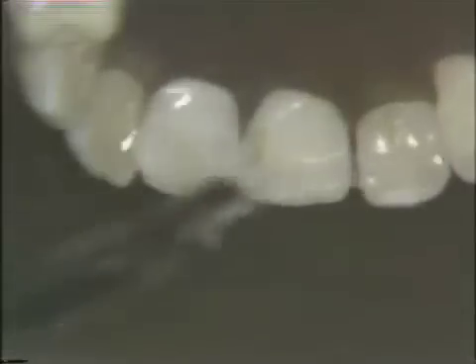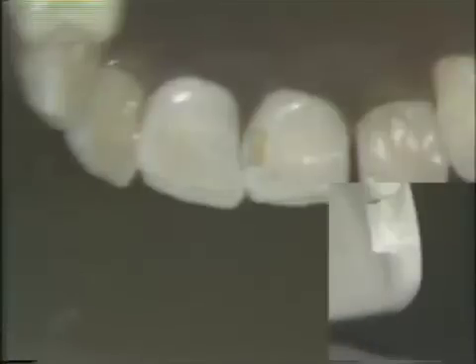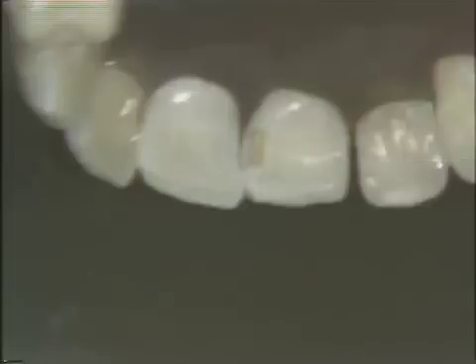Rinse it off and examine again. If you will note, there still is some carious lesion against the axial wall. This is what we are trying to reproduce now, the number 2 model that we have given you. If you will look at it, you'll see the retentive form as it goes toward the labial, cervical and incisal extensions. We have not placed any retention in our cavity preparation in the axial walls yet.